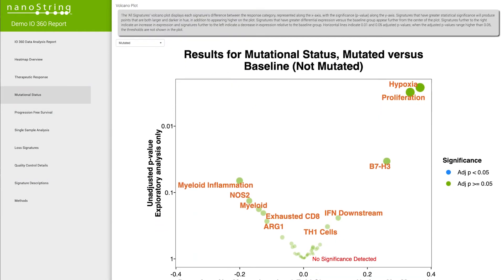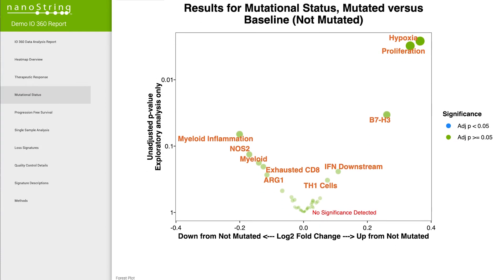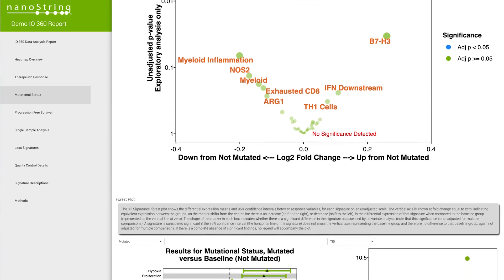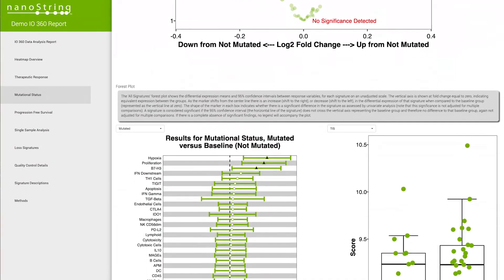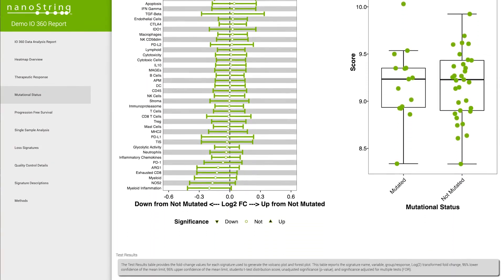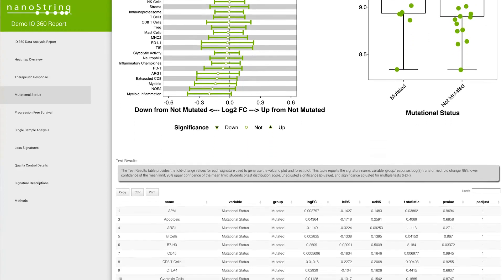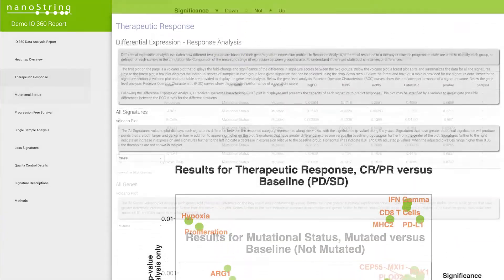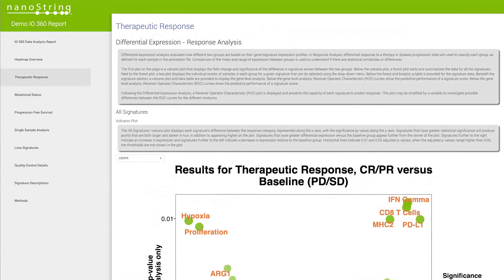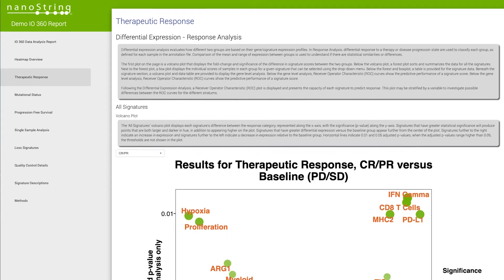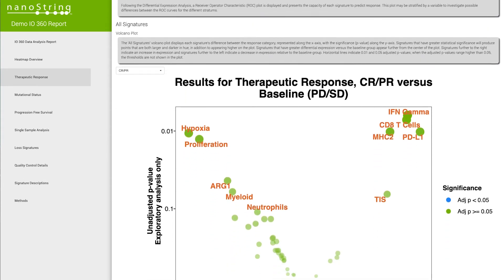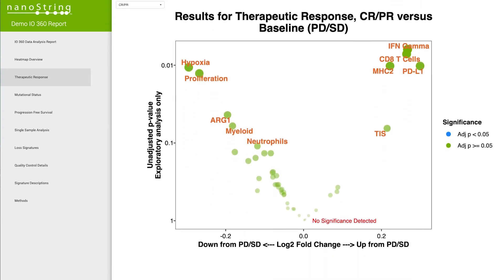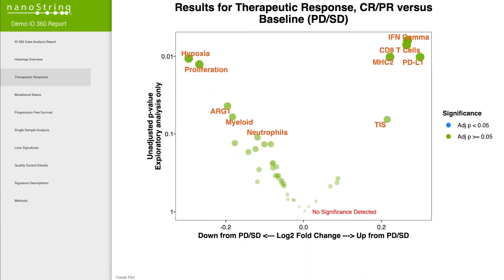A unique feature of the report is the availability of different plot types to view data in a relevant format specific to your study. For example, in the therapeutic response section, volcano plots can be used to clearly see signatures that are upregulated in responders, as well as those that are down in responders.